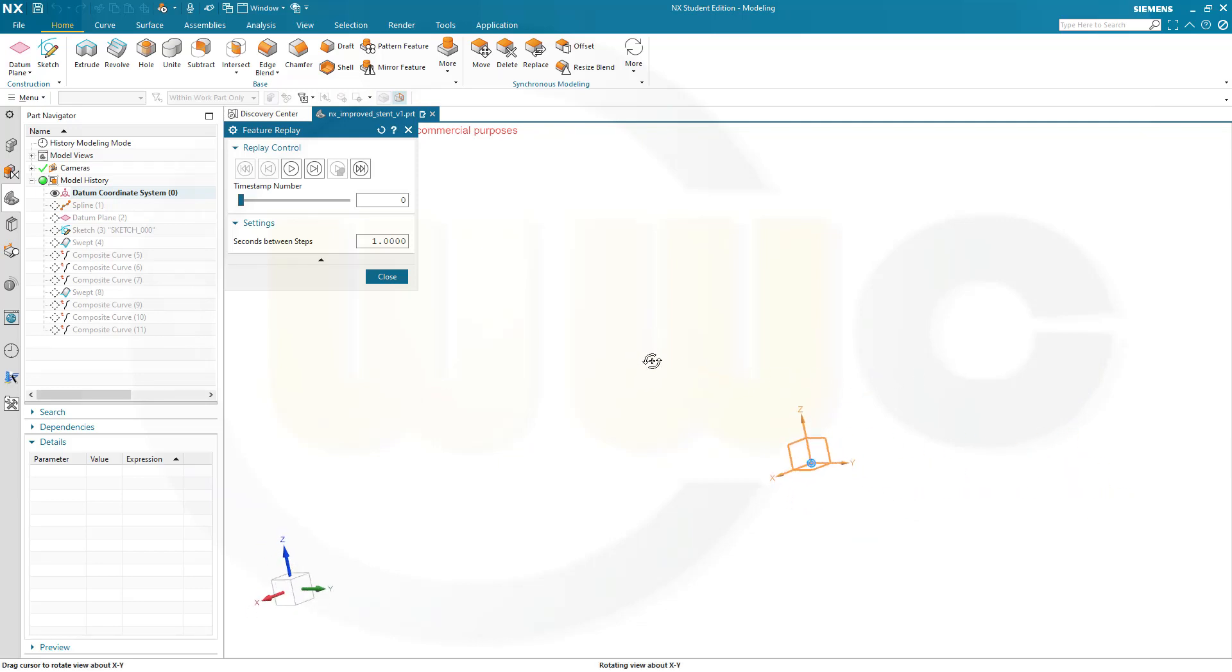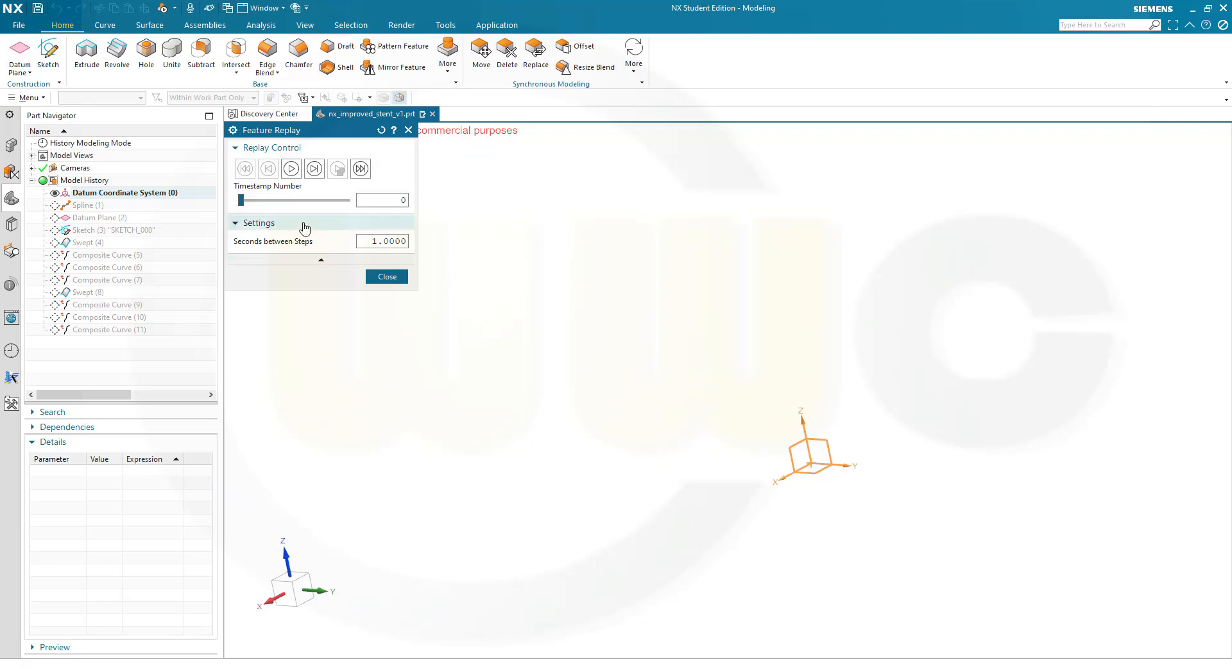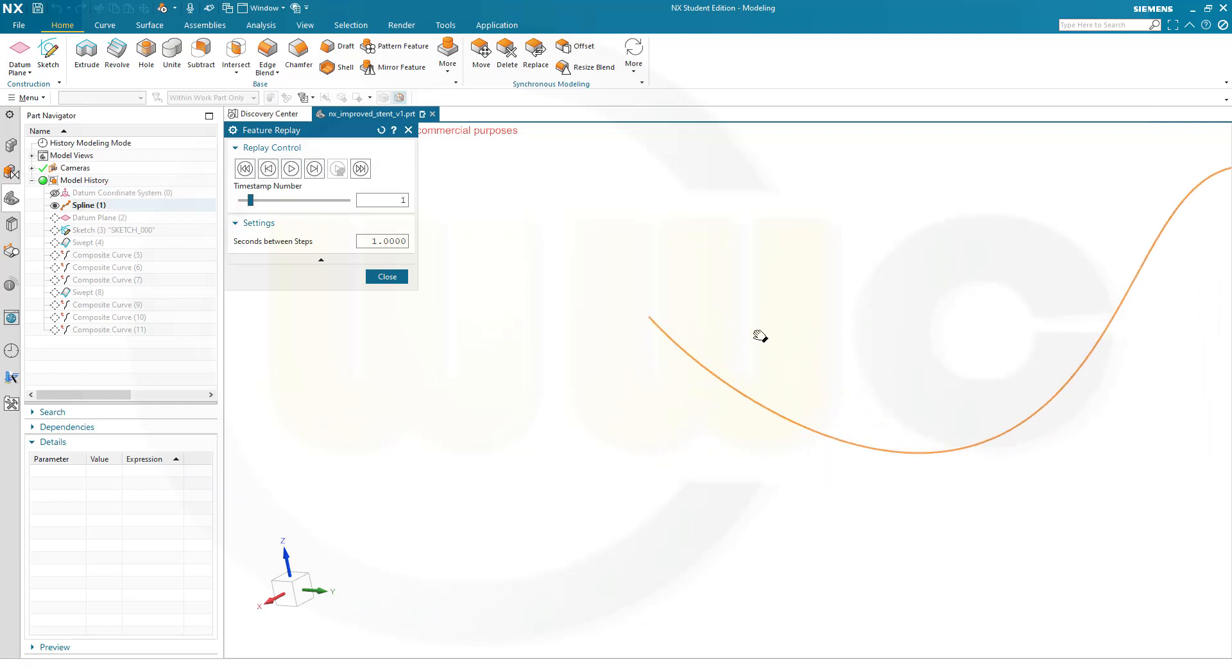I want to use the feature replay to show you what I did before. It's the same which I did in the last video. First I drew a 3D spline, then I put a plane at one endpoint normal to that 3D spline.